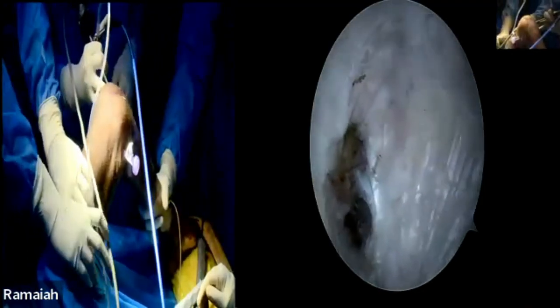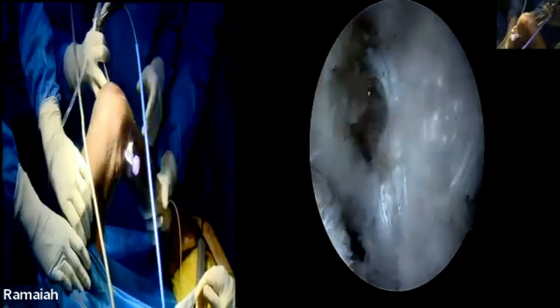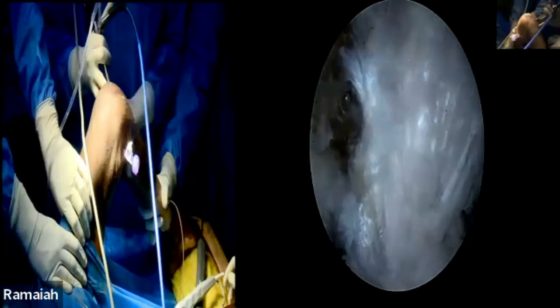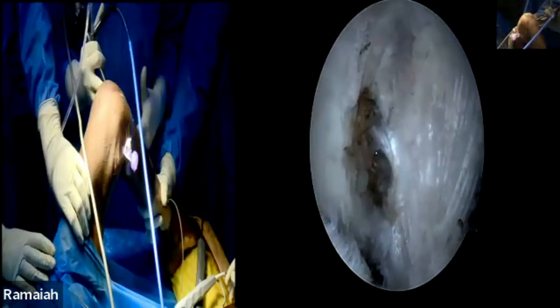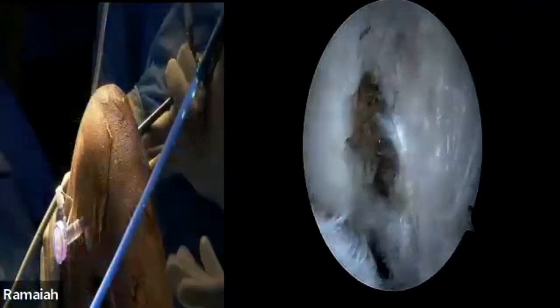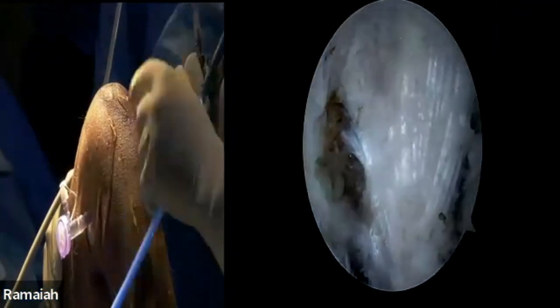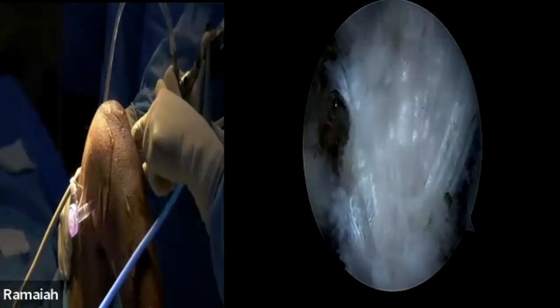I have the knee in flexion of 90 degrees — probably less than 90 degrees — and this is how I usually do PCL reconstruction. It's on a table with a sandbag down and a lateral thigh support, in flexion. I don't hang the leg down for PCL. It's a surgeon's choice; this is how I feel comfortable.